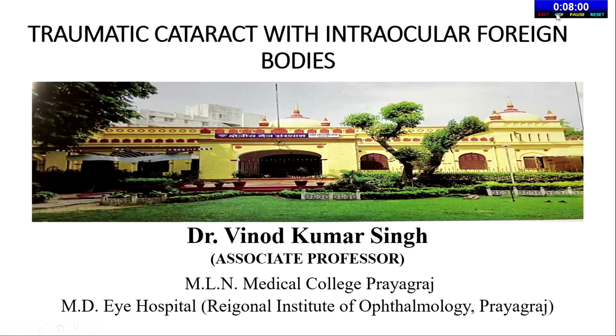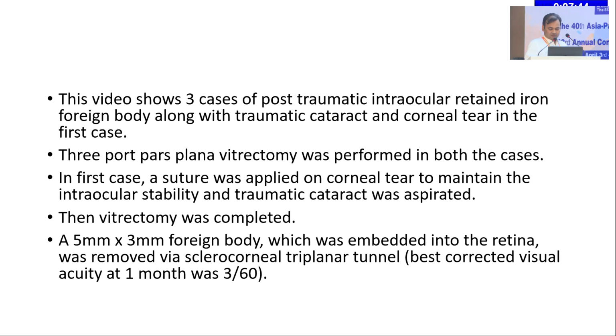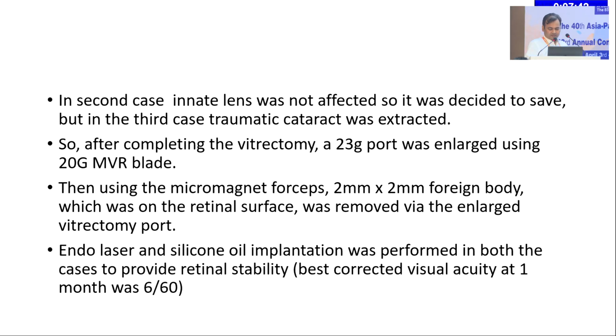Good morning, everybody, and thank you to Sakya sir and all my seniors. They have given me the opportunity to present a few of my works. Three traumatic cases are there, where there was a corneal tear and cataract, with an intraocular foreign body embedded in the retina. You'll see how I try to manage and give maximum output.